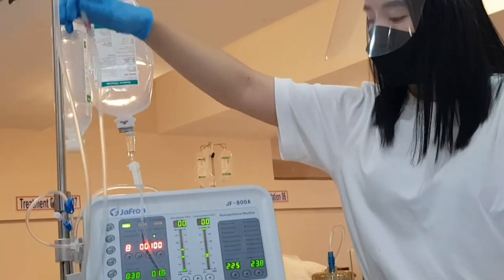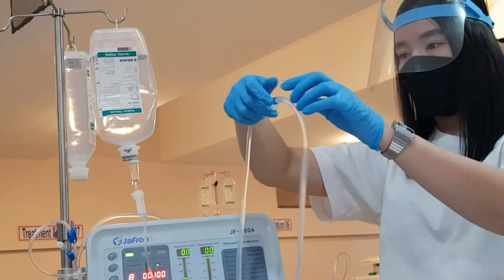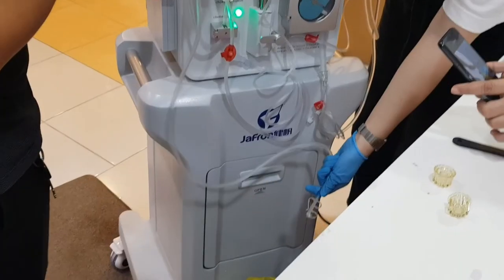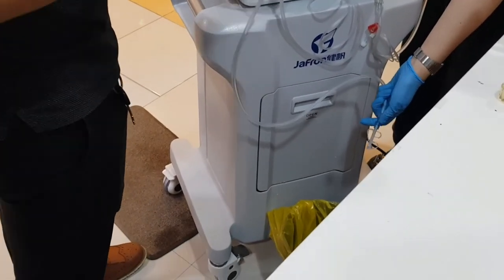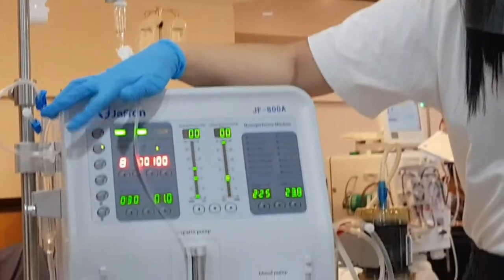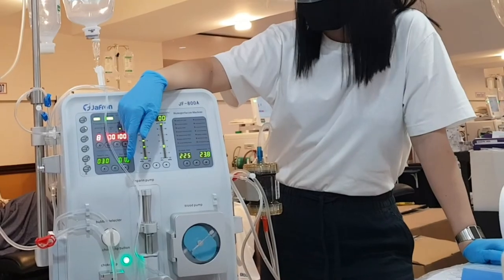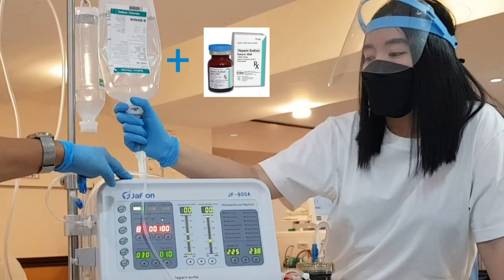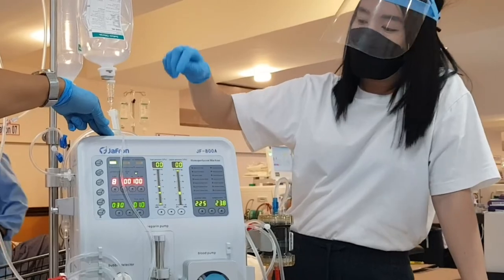Disconnect the venous patient's end — make sure the big red and blue clamps are closed before disconnecting. Place and clip the venous end on the draining bin, then open the big blue clamp. Change the D5 water solution to PNSS one liter, then start the blood pump. Drain the solution until consumed. Once done, stop the blood pump. Change the PNSS one liter to heparinized PNSS one liter — the mixture is 5 cc heparin incorporated in the one liter PNSS — then start the blood pump.